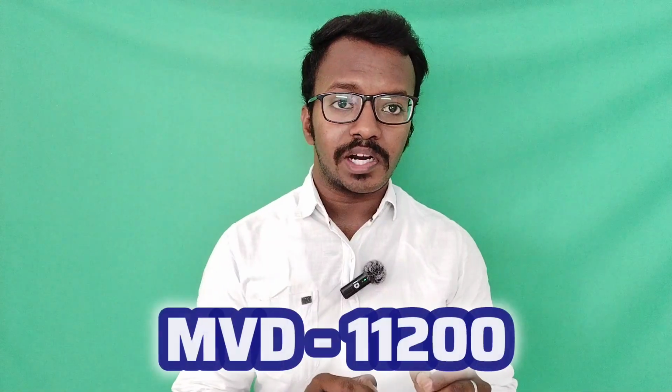Please watch it. NID refers to finding a suitable dilution to reduce the interference within the MVD. That means 11,200 is the maximum dilution. Within this 11,200, which dilution is suitable for analysis, such as 800 or 500 or 600 or 650? For that purpose, we need to perform NID, non-interference dilution.